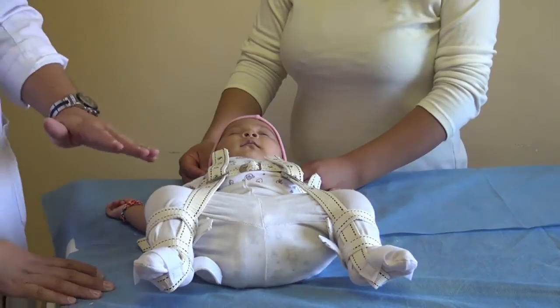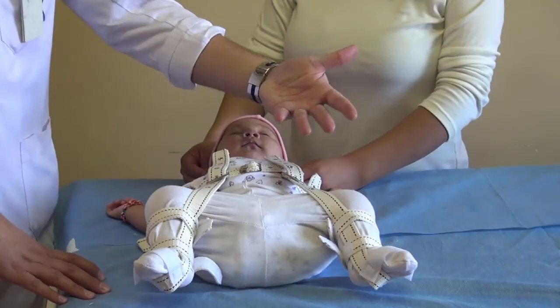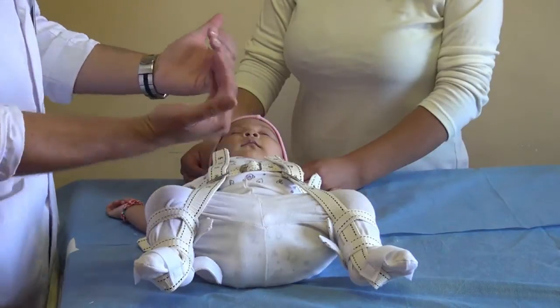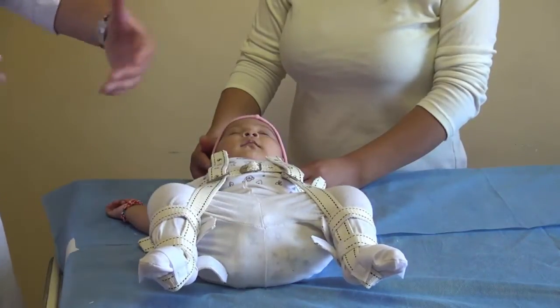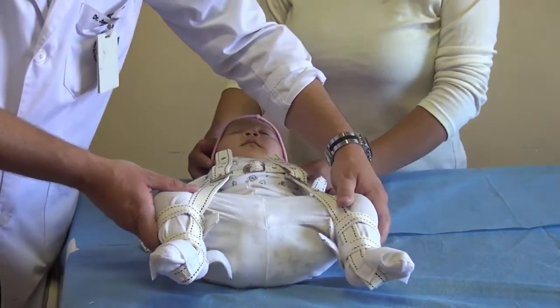When the harness is on, the baby can rest on their back or on their belly. But we tell the parents to be careful when carrying — if they carry the baby on the front, it will close the legs and the harness won't work. We tell them to carry the baby over the parent's hip on the side, so they maintain the abduction.